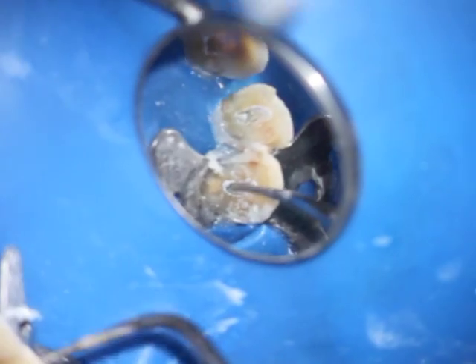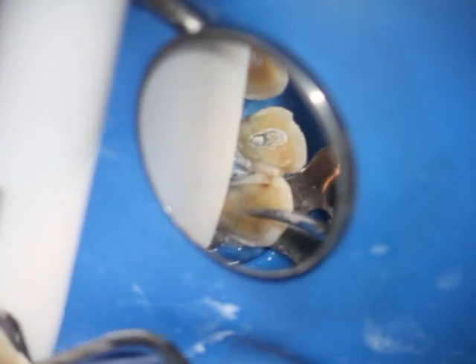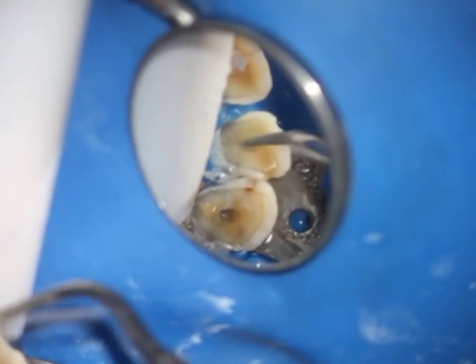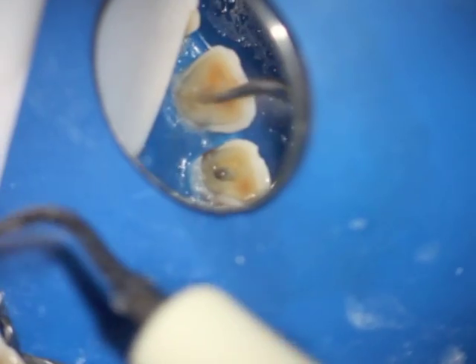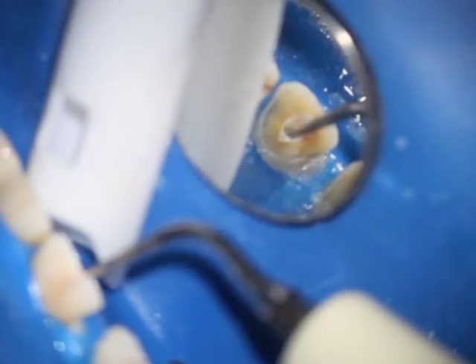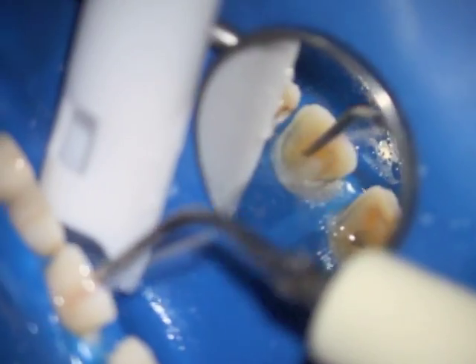All fitting of the gutta-percha should be done prior to the placement of the cement, and all gutta-percha cones have to be essentially locked with locking pliers at the reference point, and that should be confirmed later on when cementing. Following the cementation of the tip, the remaining sealer that backflows around the cone up into the chamber has to be cleaned off.